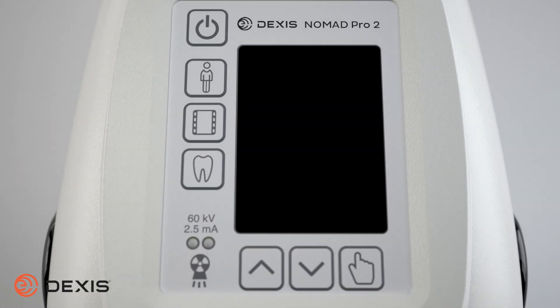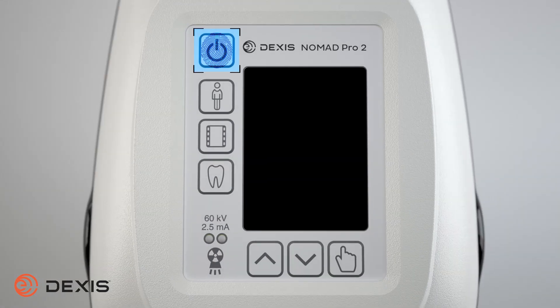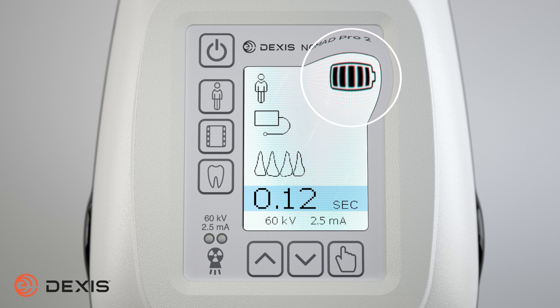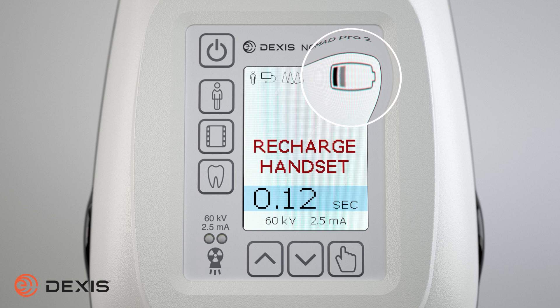Now that you have attached the handset, press the power button. The display panel will illuminate. The battery level icon is in the upper right corner; five bars indicate a fully charged battery. If the battery is too low, the Nomad will not emit x-rays and the recharge handset message will display. If the handset is not fully engaged, you will see a handset failure alarm message.